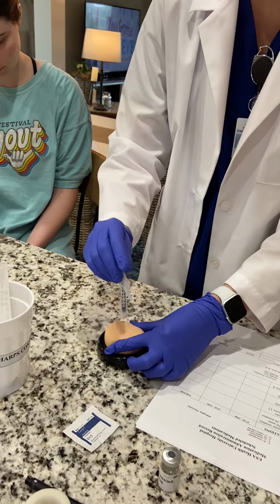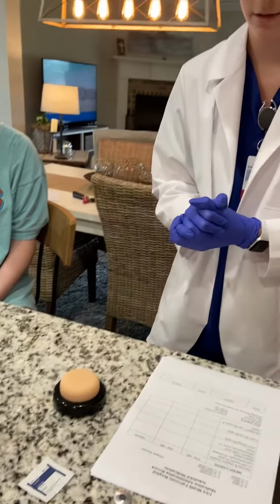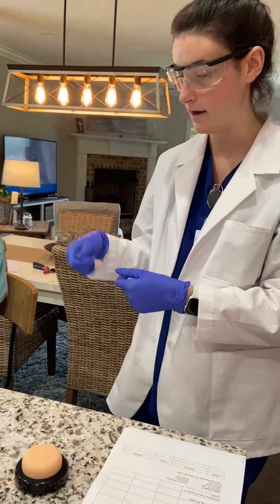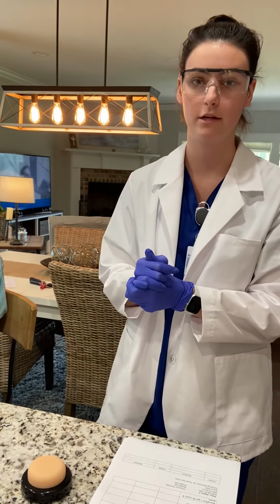Okay, I'm going to put the cap up, put it in my sharps container, and now I'm going to note any allergic reaction in the patient, if the patient is having any discomfort, and I'm going to make sure they're comfortable, and I'm going to document it, and that completes my medication administration checkoff.